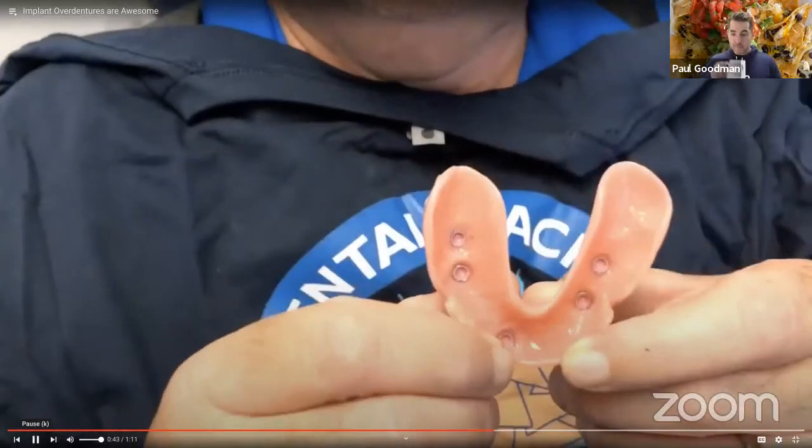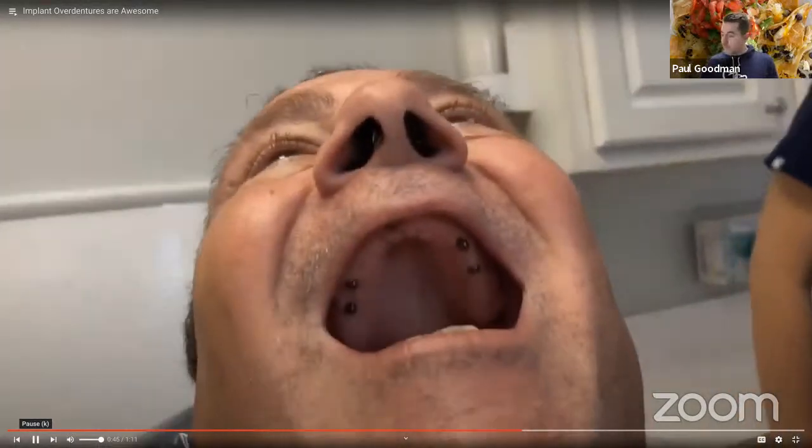Position there. There are the snaps inside of here. I'll just take a look there. They're the snaps there. And our menu. Then you see the little tiny locators. Those are the extended range ones. I usually do just the regular gold ones. This happens to be extended range ones. You see how this fits inside the mouth.